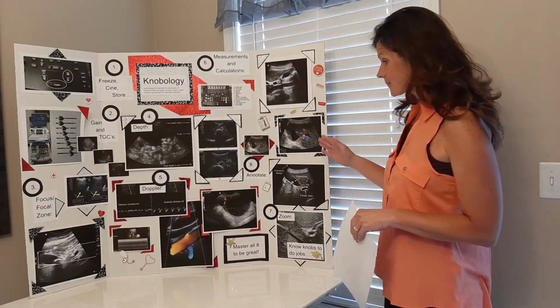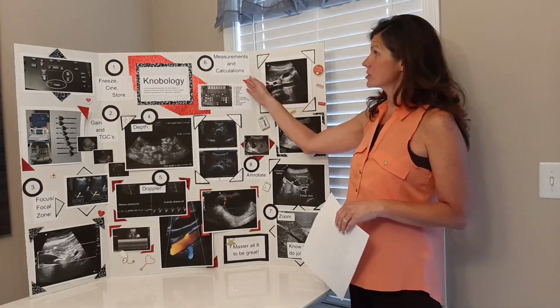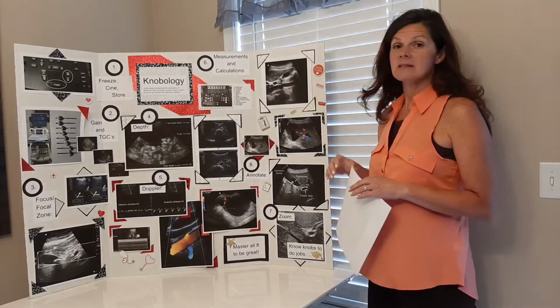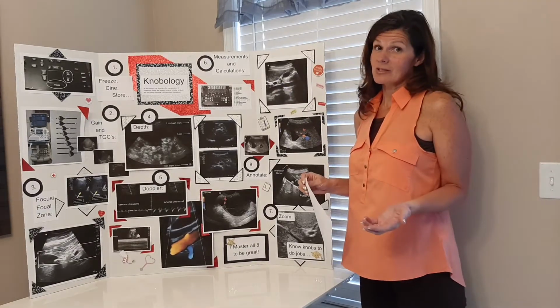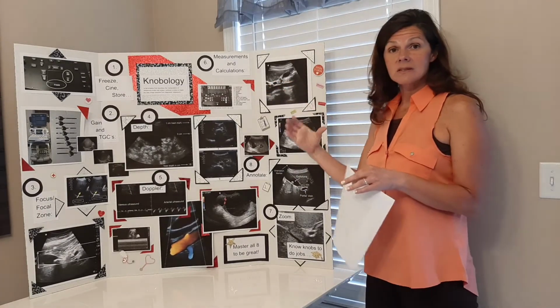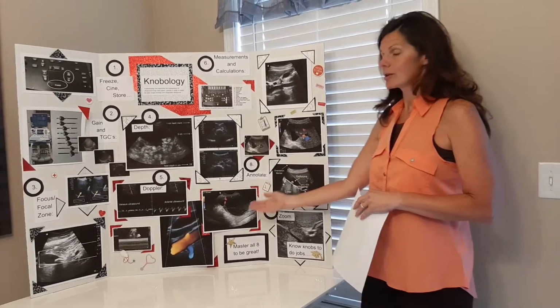Also, another important feature of the ultrasound is its ability to measure and do calculations. A lot of times radiologists want to know what the diameter of a vessel is. For instance, the abdominal aorta, we don't want it to be dilated or there's an aneurysm, so they're going to want to know by the tech placing calipers on the vessel to see what the diameter of that vessel is. Or if there's a mass, they want to know how big it is, or the volume of an ovary.